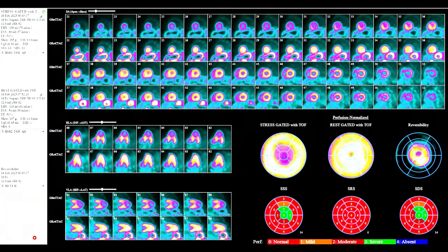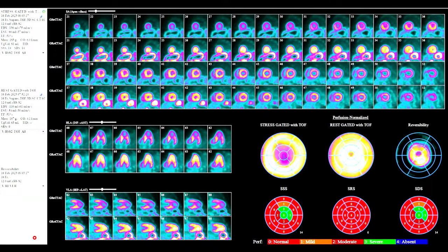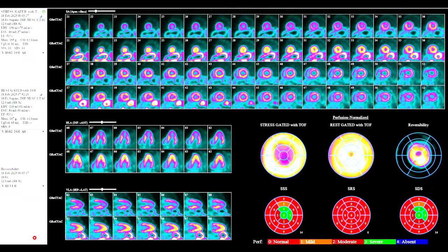Maybe not in these type of patients with hypertrophic cardiomyopathy, where there is probably an underestimation, especially in the apical segments. And the change from stress to rest is still relative, right? Even if you're underestimating or overestimating, the change is still relative. Lack of augmentation, I think, still has some value. Yeah, and we'll talk about why we see what we see in some upcoming slides, especially in terms of the cavity.